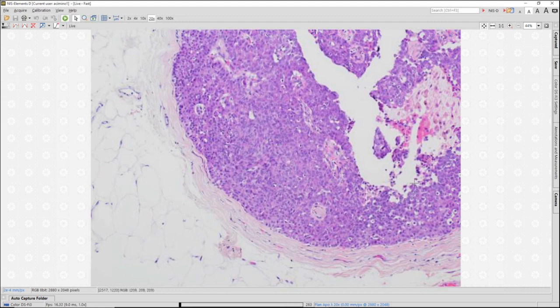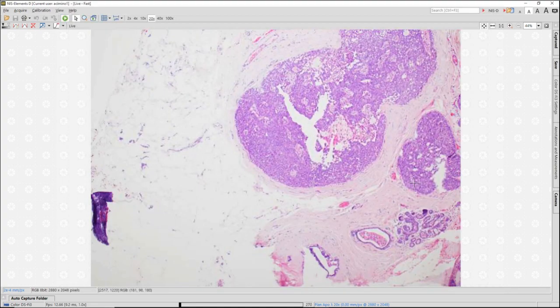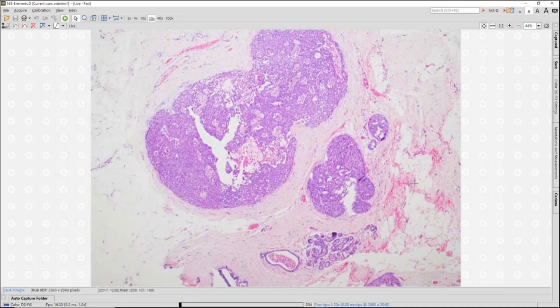It's low nuclear grade. It typically forms a single mass, but sometimes can be a few nests. But even if it shows these kind of 3 different nests, say, because it's expanding through this duct that's sort of branching this way, the contours are smooth, there's no desmoplasia, and it's low nuclear grade. Invasive papillary carcinoma has to show irregular nests that have higher nuclear grade and a desmoplastic response.